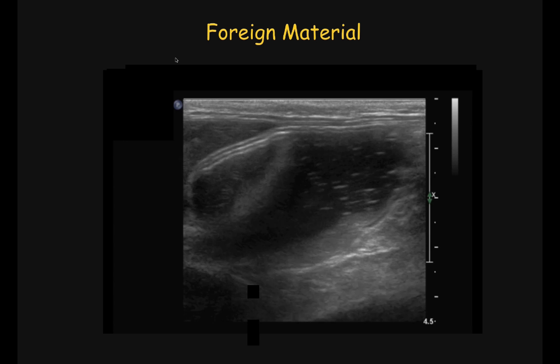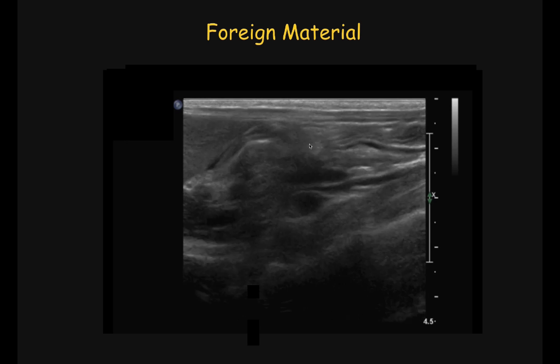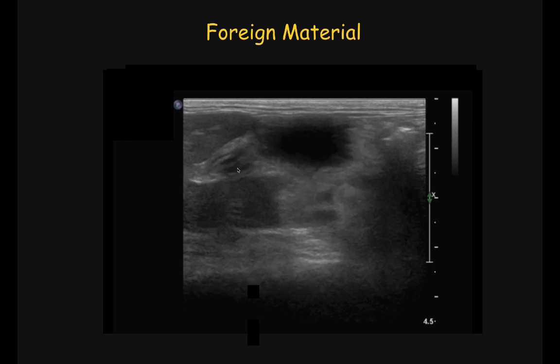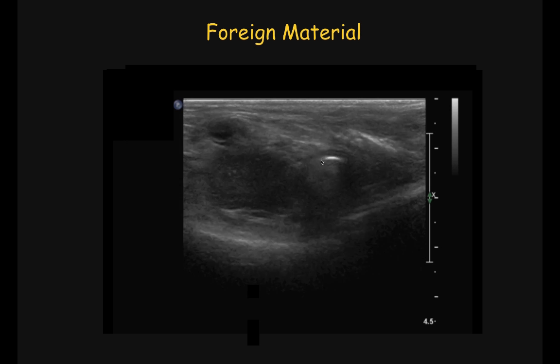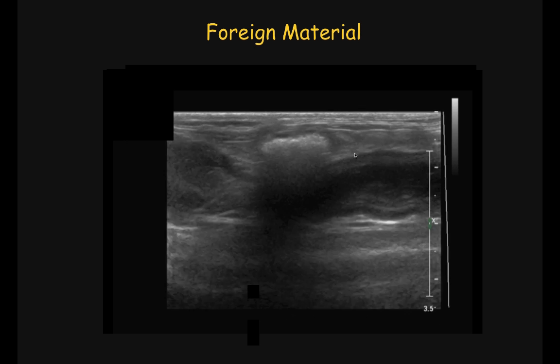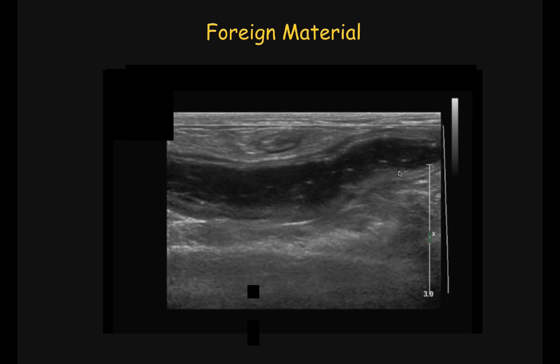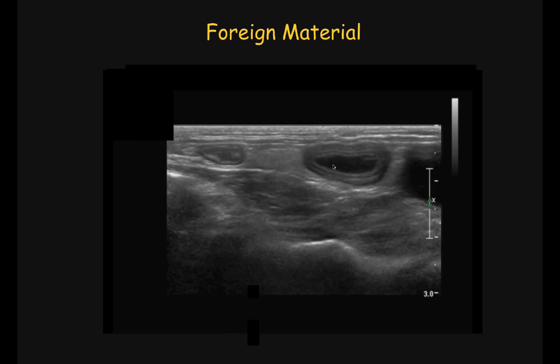There is a large amount of fluid and gas with reverberation in the fundus of this cat presented for acute vomiting. The antrum is collapsed, and then as we follow the duodenum, we observe that it is fluid and gas distended. It reaches up to 1 centimeter in overall diameter. There is very little peristaltic activity.